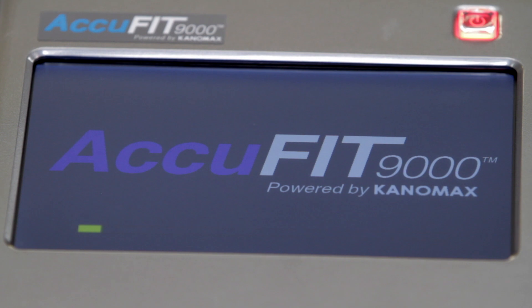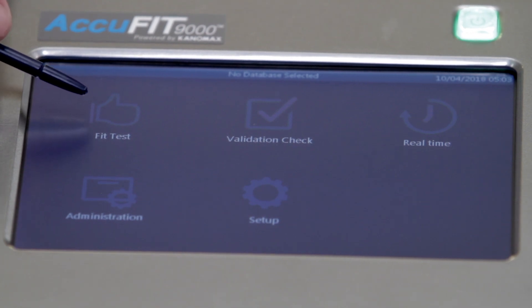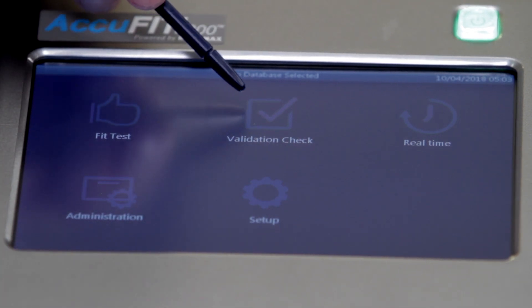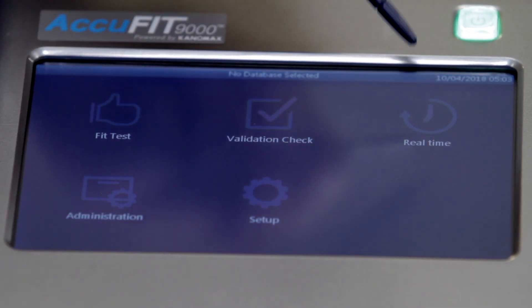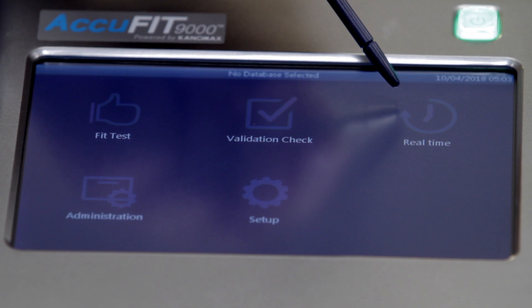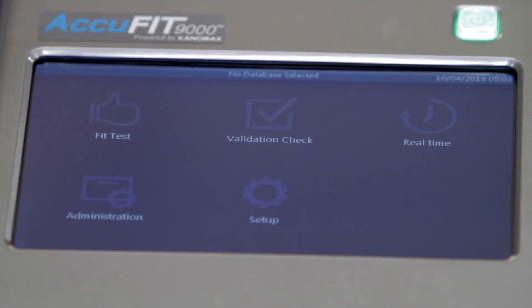When the AccuFit is turned on, the main screen for both standalone and PC mode will provide access to the following activities: Fit Test to perform a respirator fit test, Validation Check to conduct a system check prior to daily fit testing activities, real-time measurements for both ambient and mask sampling, access to administration functions, and access to setup functions.